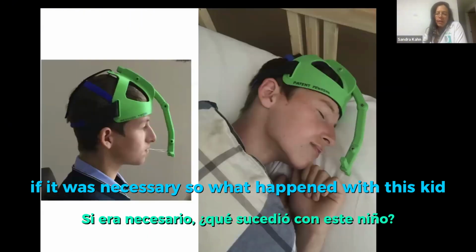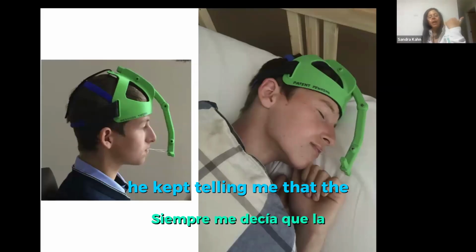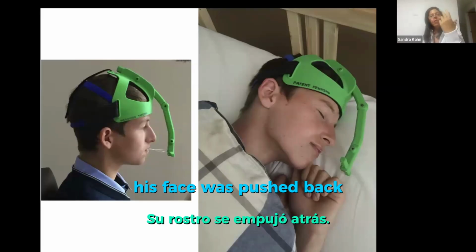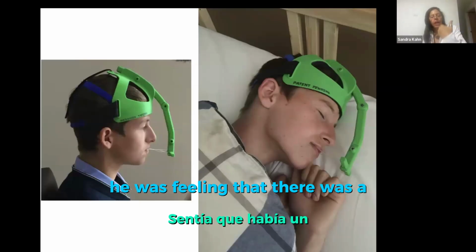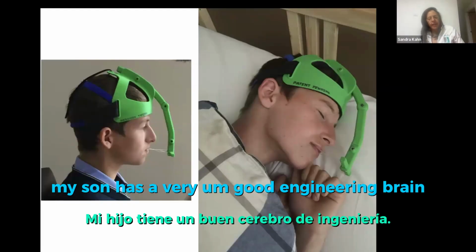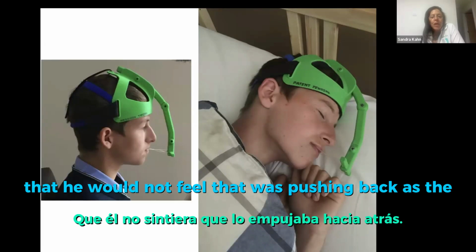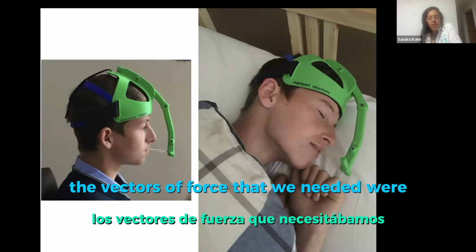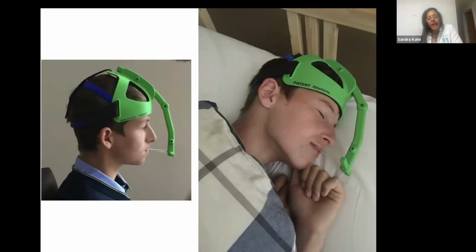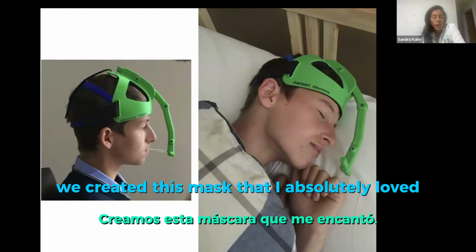So what happened with this kid? There was a point where what we were doing was not working. He kept telling me that his face was being pushed back with everything we were doing. He felt there was a vector of force going back. So we started inventing. My son has a very good engineering brain. We started playing with 3D printers and trying to come up with something that he would not feel pushing back, with the vectors of force that we needed acting on his expanders. And it was working. We created this mask that I absolutely loved.